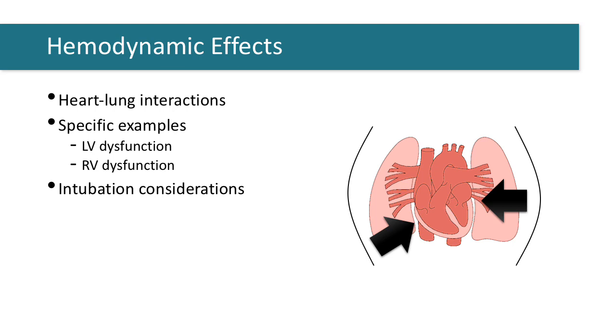When you place a patient on positive pressure ventilation, the pleural pressure is now positive, and the pressure gradient across the myocardium is greatly reduced. This reduces afterload and improves LV performance substantially. However, LV dysfunction can become an important problem when weaning mechanical ventilation because the progressive reduction in positive pressure and the increased respiratory muscle action lowers intrapleural pressure and thereby increases afterload. So you can think of weaning mechanical ventilation as a kind of cardiac stress test.